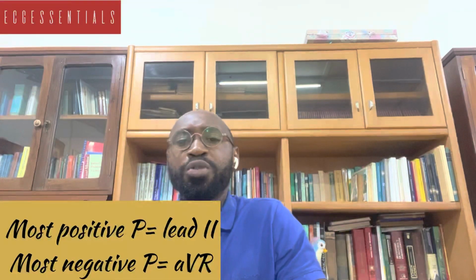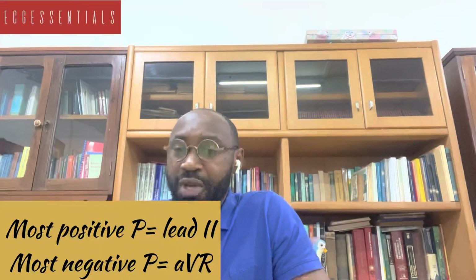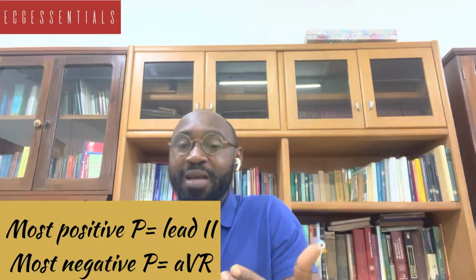The P wave amplitude is usually most positive in lead 2 and most negative in AVR, and it's again because of the same orientation.